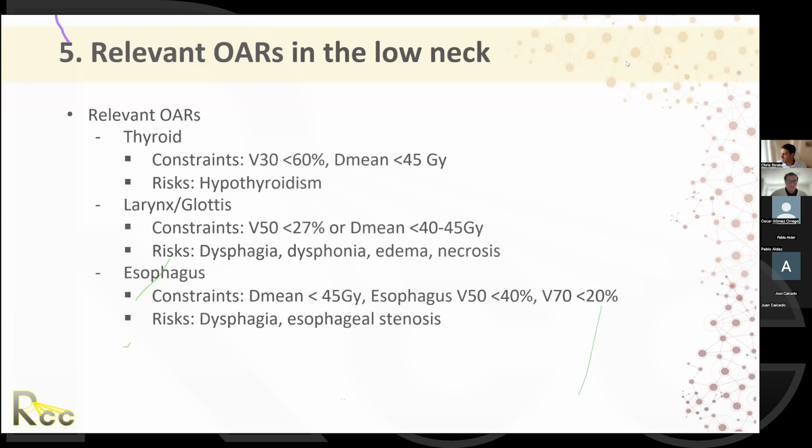So I know we have now 13 minutes left. I can show some contouring examples of those OARs if that's helpful, or we can take this whatever way is most helpful. I think that's helpful, Chris.